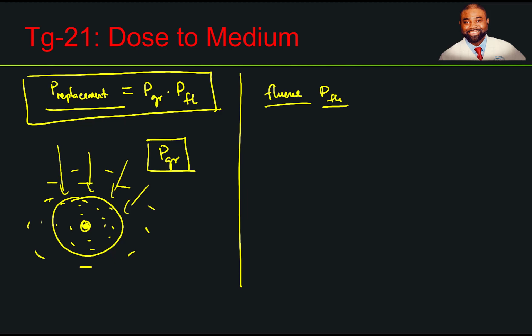And when they undergo interaction for a larger extent, it leads to a forward peak in electron fluence because they are of higher energies. That explains why the fluence correction factor is more important for electrons than for photons. Now, you can read a lot further about this in Attix, page 255, and you will get this.